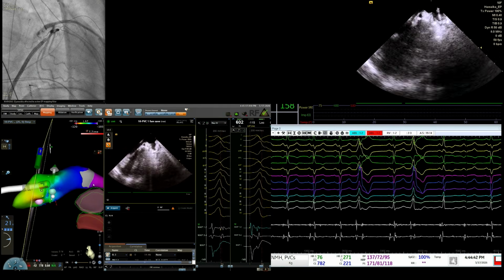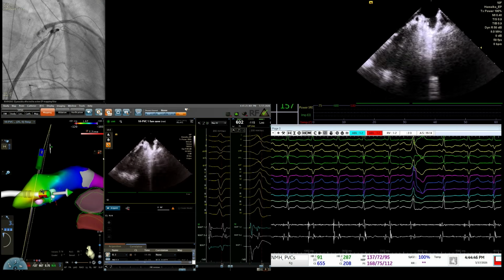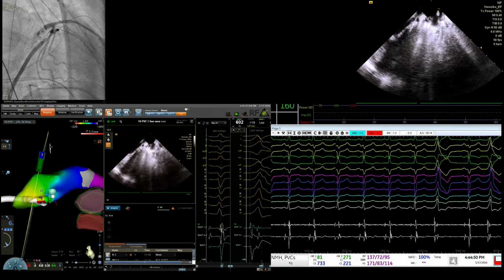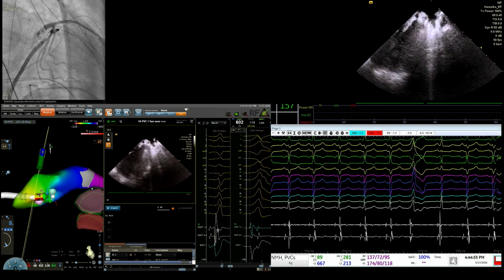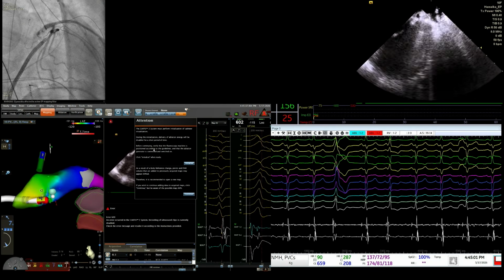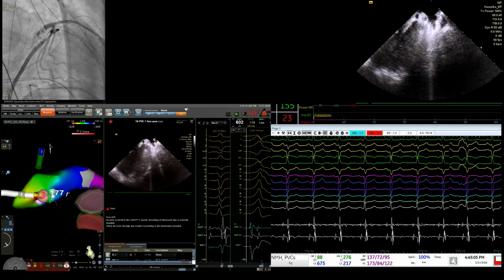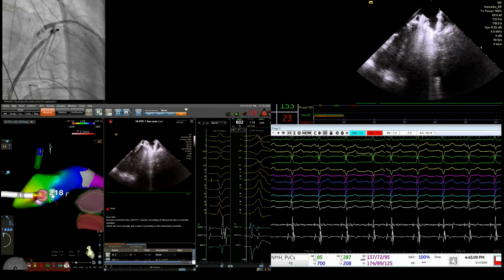Yeah, okay. So I'm going to put the tip down again. There, okay. Come on at 20. Oh, they're gone. Now stop. They went. Okay, go ahead, 20. This is so close, and you can see eyes.